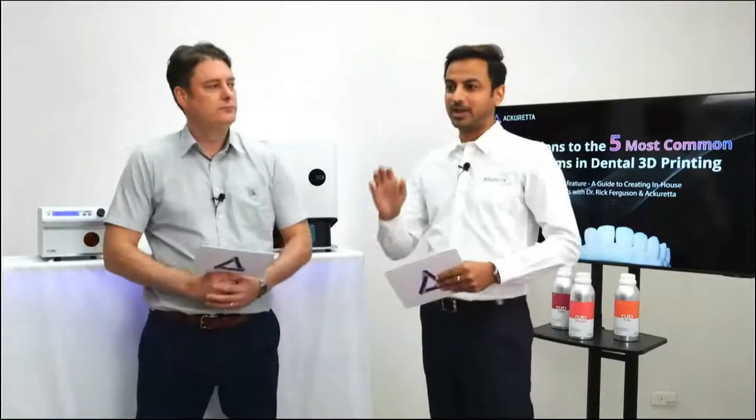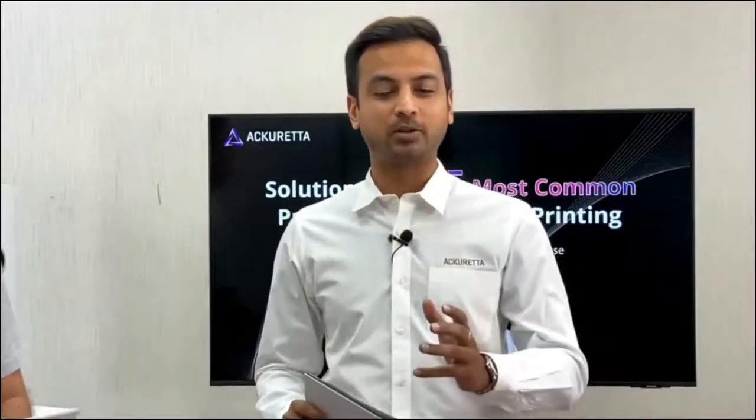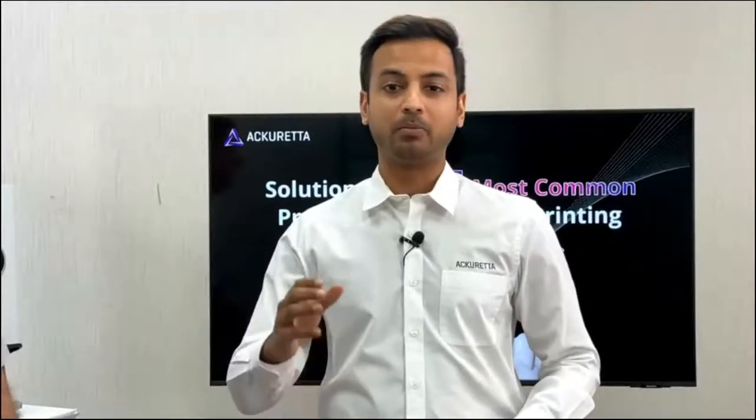A little lesser known fact is that 80% of the curing done in a 3D print process with polymers is at the post-cure station, and only 20% of the curing is actually done on the printer. Since it's such a large percentage, most of your mechanical properties and your biological properties in terms of safety, biocompatibility, irritation, and others according to different ISO testing standards are basically given by the validated post-cure process. So I would say that's very important.